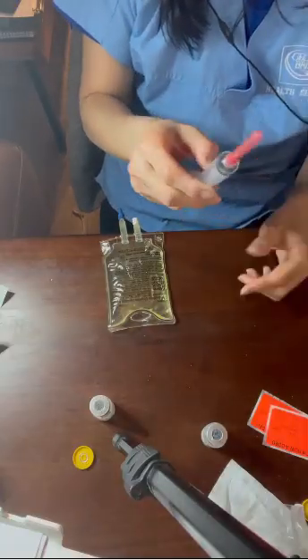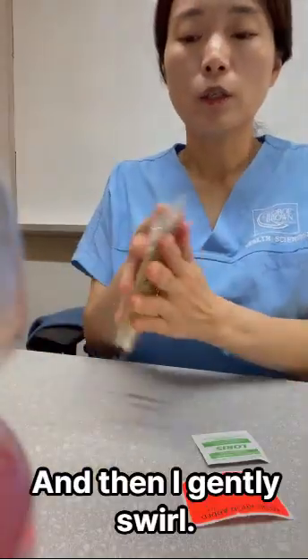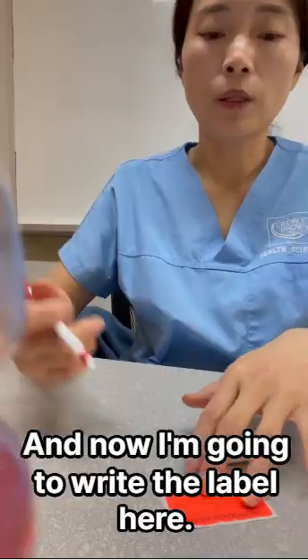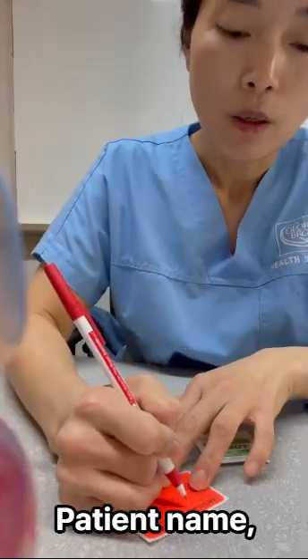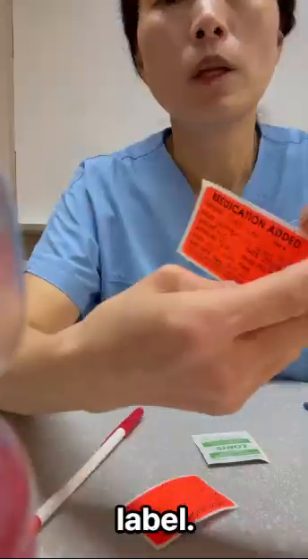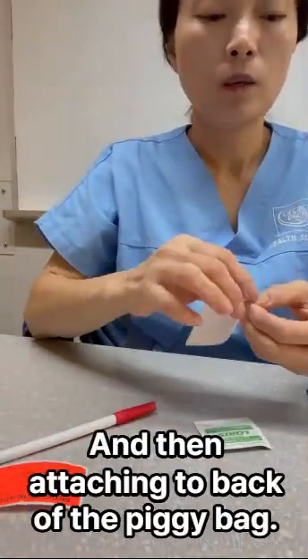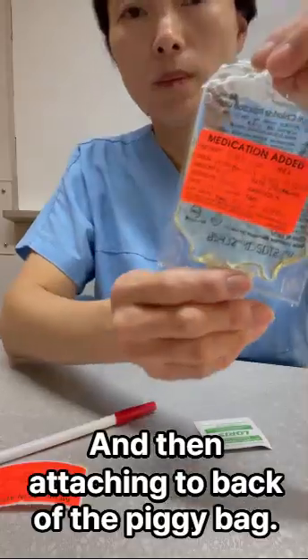Then I cover the cap and put it in the sharp container. And then I gently swirl. And now I'm gonna write the label here. Patient name, Sin Lee, and drug is pantoprazole, and time of run for 20 minutes. Label. And then attaching to back of the piggyback.